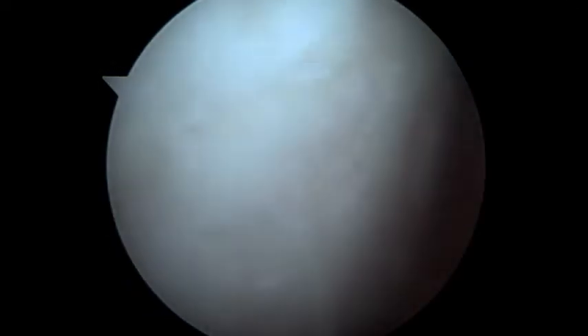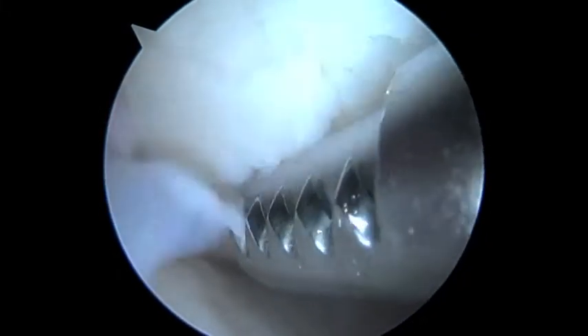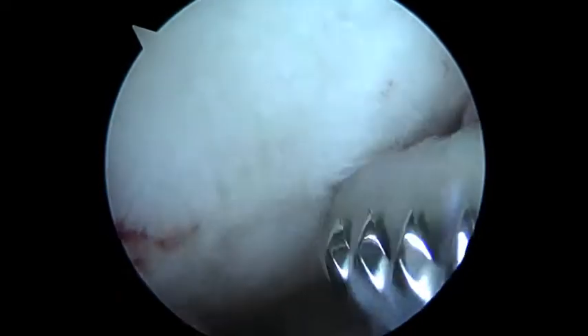I'm going to put the shaver in here. Sorry for the moving of the camera — I had to just change hands. Now we're going to put the shaver in here, clean up the edges, and then we're going to have a look at the patellofemoral joint before we inject our stem cells.